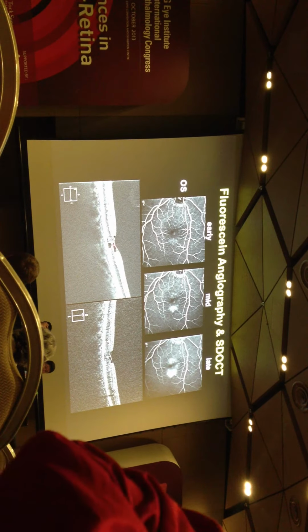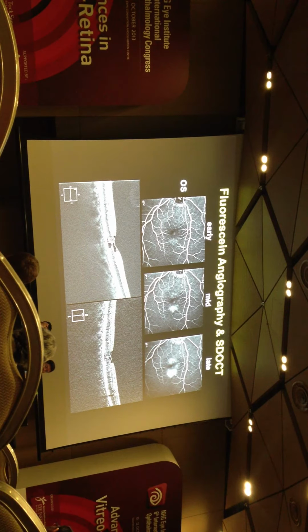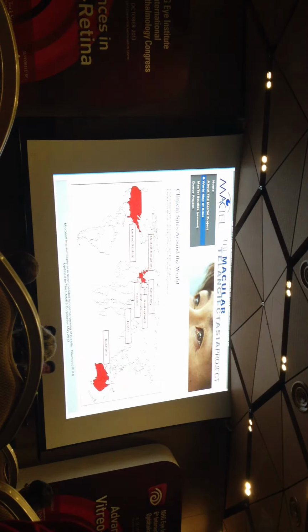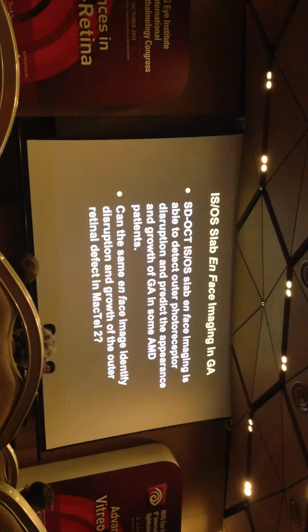And this is a slightly more advanced case. To get these cookie cutter defects, you can see this increased hyporeflectivity between the IS-OS zone and the RPE here. Okay. So we're part of the MACTEL project. We have over 100 patients now. This is a global initiative coming out of Australia to try to figure out what causes this disease.